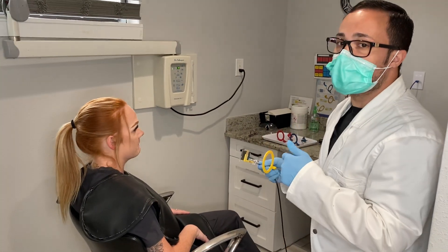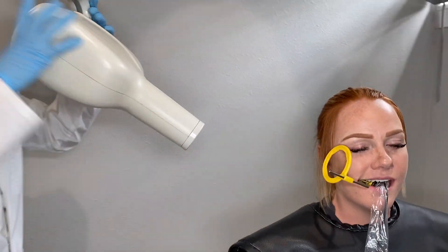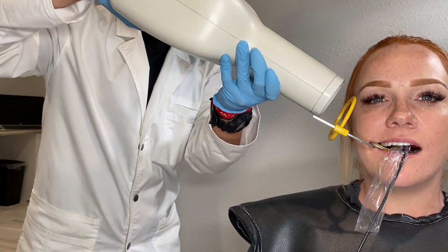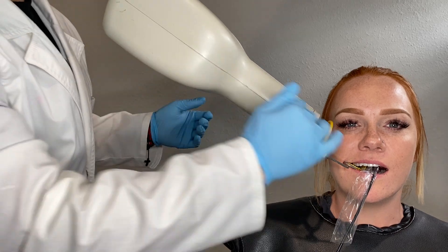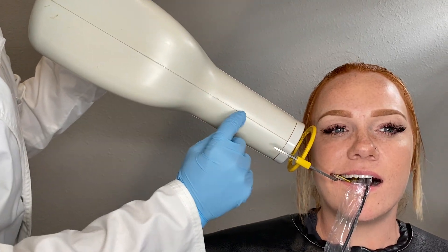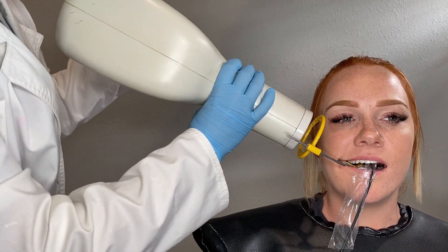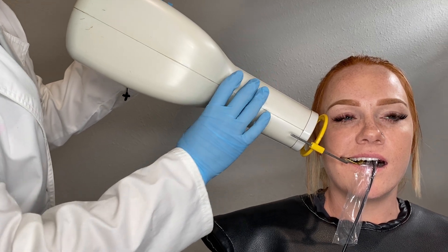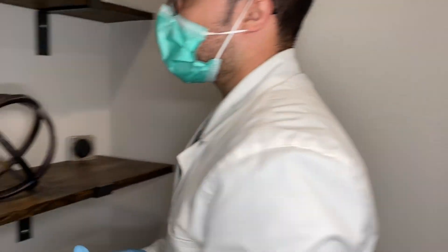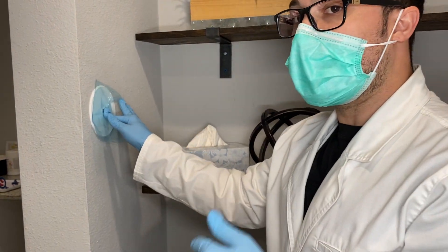When it says 'sensor ready,' that means we're ready to start the next image. When you're lining up your x-ray tube to your target, make sure this line is parallel with the arm of your ring — that metal bar needs to be parallel with this. You don't want it angled, and you don't want it not lined up with the circle. So you've got to make sure it's pretty parallel. Remember to completely remove yourself out of the room whenever you're shooting the image, and hold the button all the way in until you hear that beep stop.